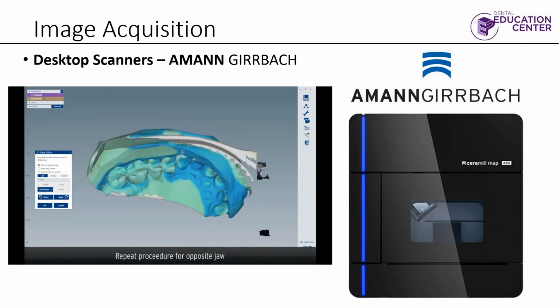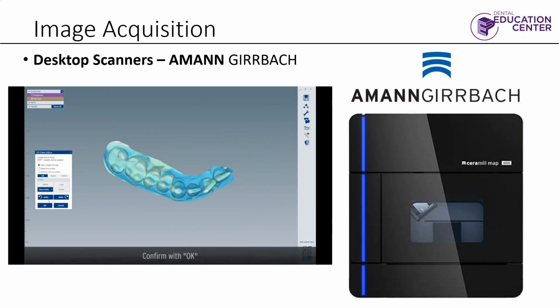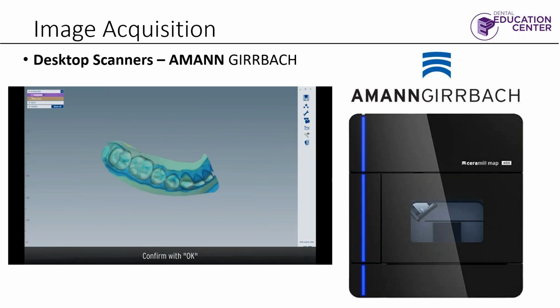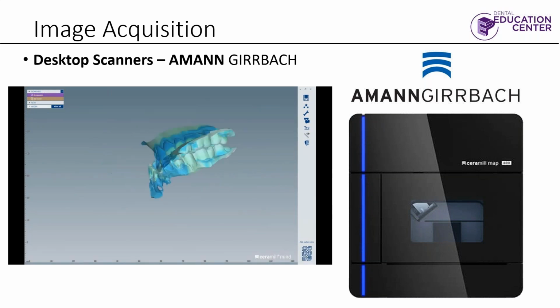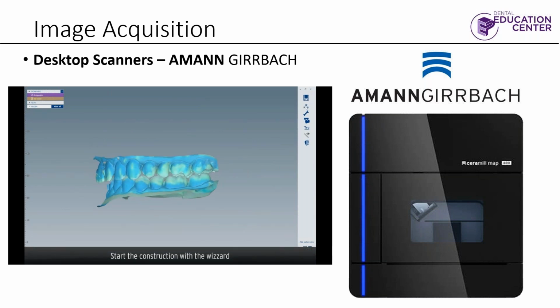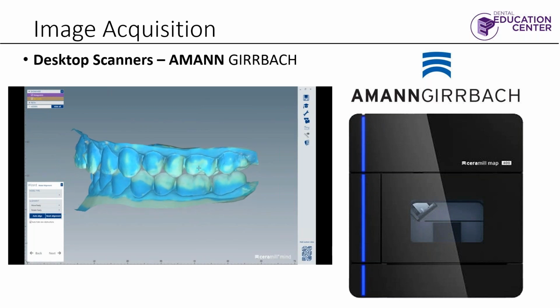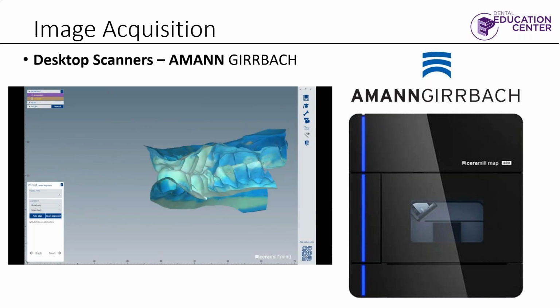Do the opposing. And the great thing is it articulates it. I always thought that was the coolest part. So it's pretty cool technology, coming from an impression to an actual, usable record.